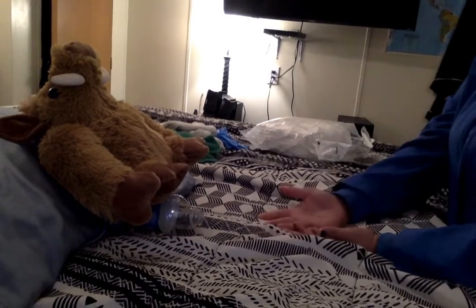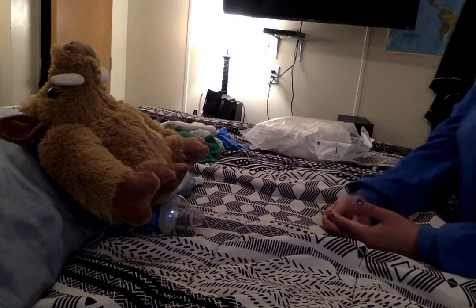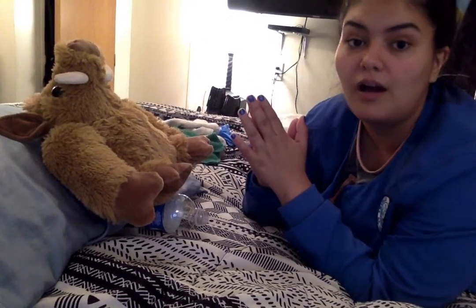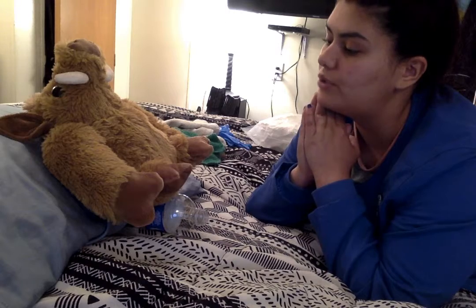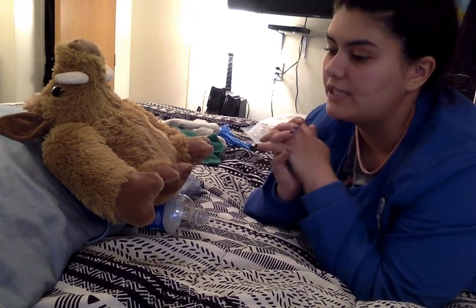So now I'm going to explain the physician's order to the patient, and I'm going to make sure that she agrees to having a urinary catheter inserted. So, Miss Lynn, we're going to go ahead and insert a Foley catheter today because you are having urinary retention. Is that okay with you? She says, yes, that's fine.